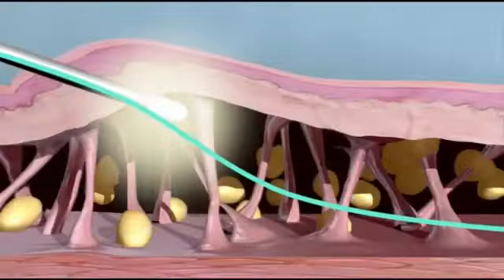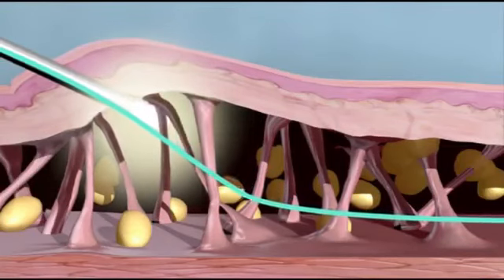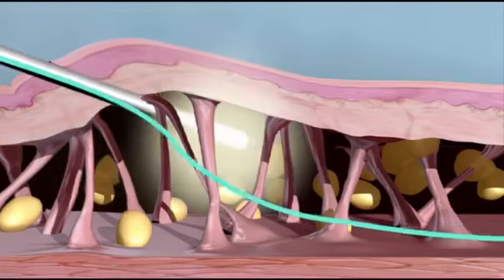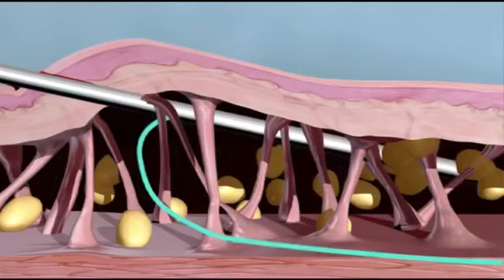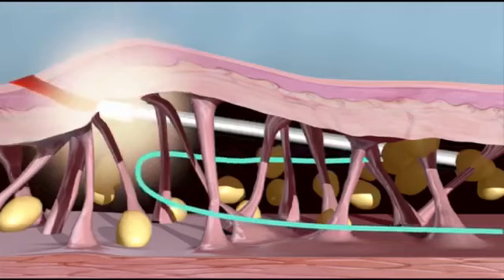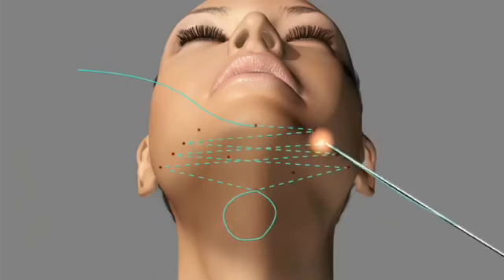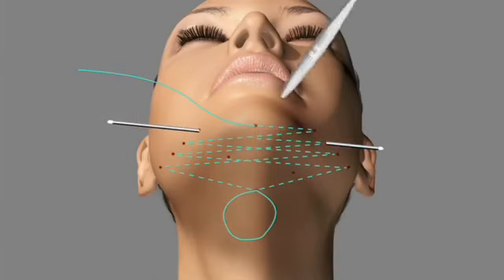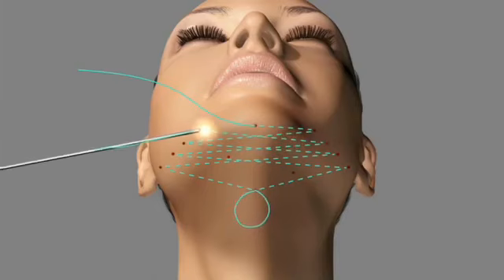Once again, illustrating the rod as it is rotated, encircles the ligaments, and then engages and is advanced downward underneath the jawline. With each passage of the suture rod in the subcutaneous space, the suture is grasped by the surgeon and pulled, thus keeping tension on the suture throughout the entire operation.